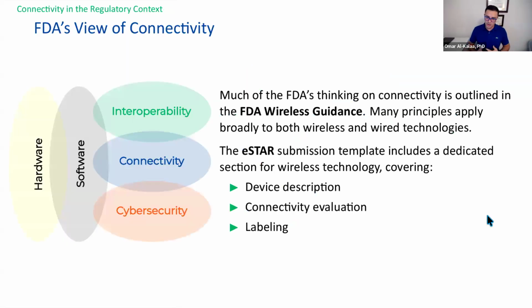That introduction really leads us into how does FDA view connectivity and wireless technology in general. The FDA has a wireless guidance that has been in existence for quite some time. That wireless guidance is not technology specific. It offers high-level thoughts and considerations for the different topics that should be considered by a medical device manufacturer when they're designing their wireless medical device.